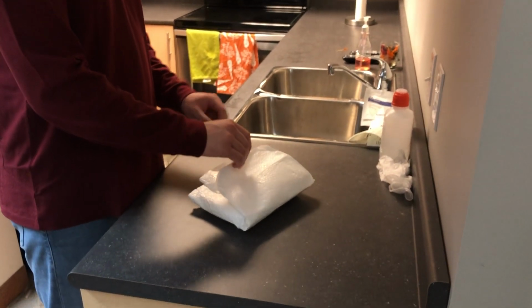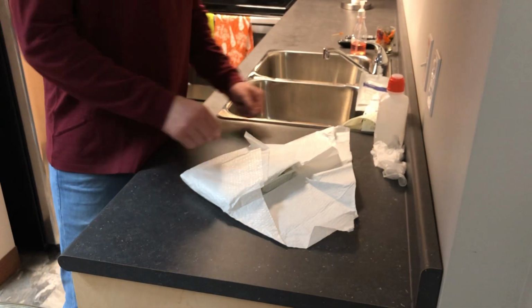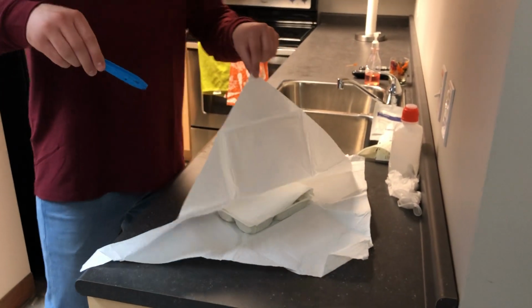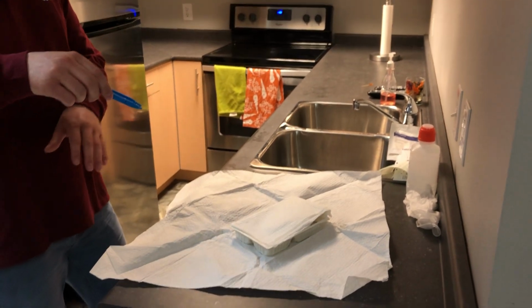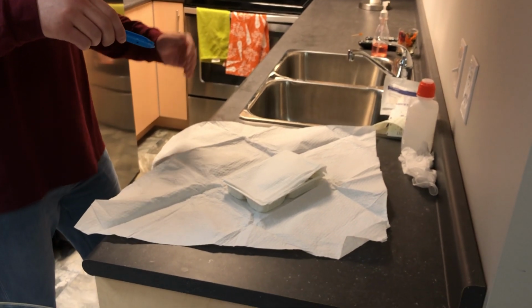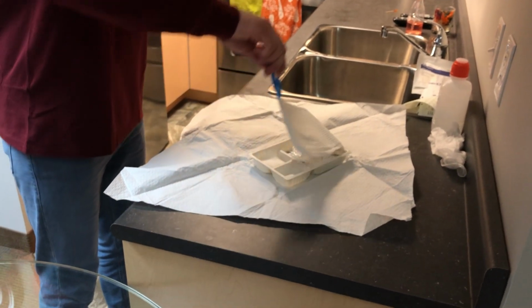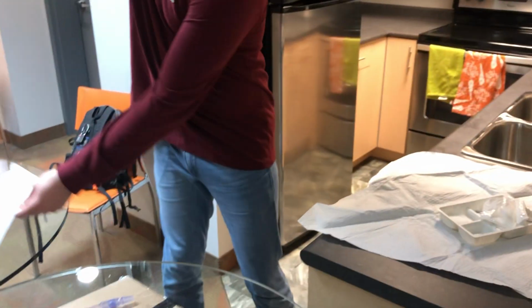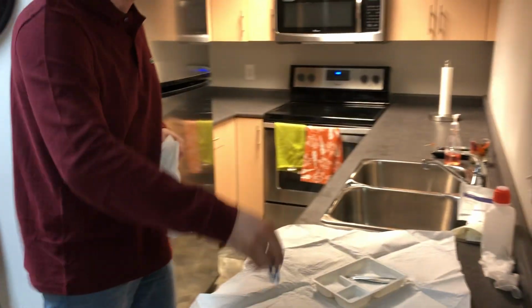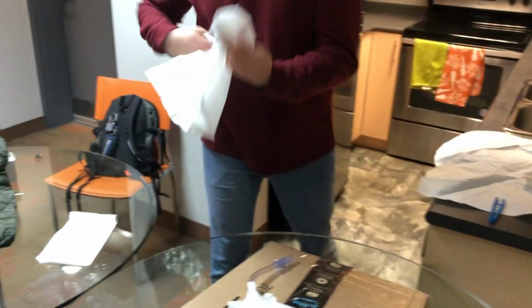So first I will set up my tray here and create a nice space. Grabbing my blue forceps. Now some of it's hanging off, so within this border here is going to be my 1 inch border. So then I can grab my drape, discard that, I won't need it. And I can grab my garbage bag here. I'm going to be using it at the patient's bedside. Put it between their legs.